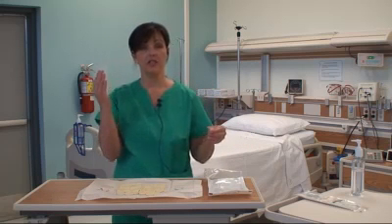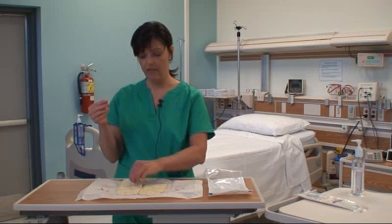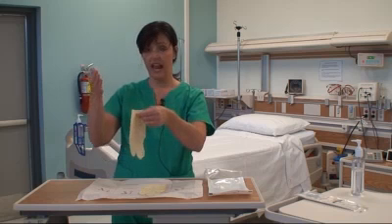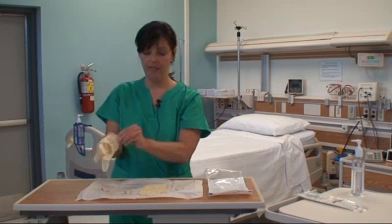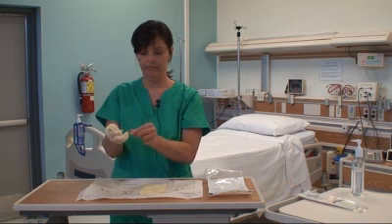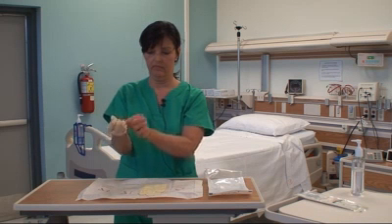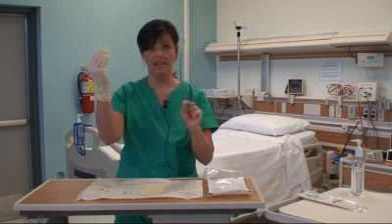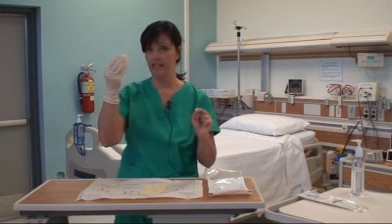The practice is to don the dominant hand first, and I am right-handed. So I'm going to pick up my glove, touching only the inner aspect of the glove — picking up with my left hand and keeping my thumb inward. I'm going to slide my hand with my thumb into the glove. Then I can pull the inner aspect of the glove back so that it's on my hand. Now this hand is sterile, and I have to be very cautious about what I touch so I don't contaminate this glove.